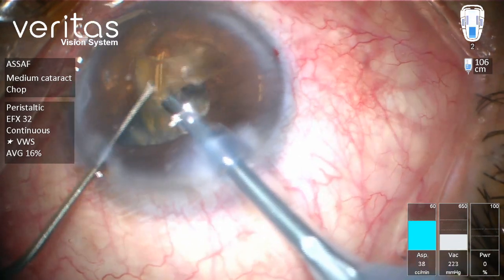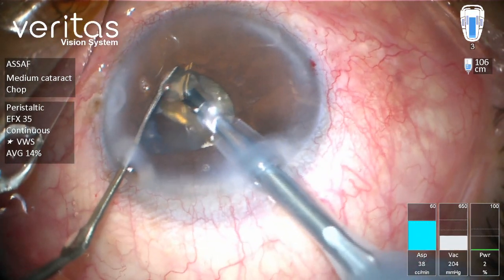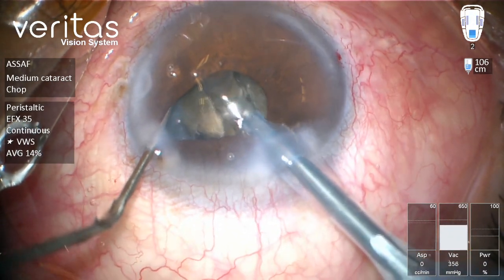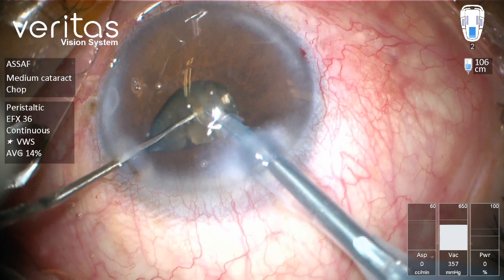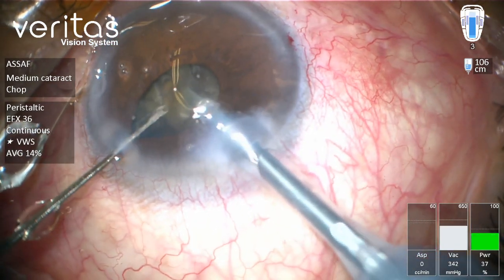As you can see, this is a pretty dense cataract and the pupil is getting smaller. I'll pass behind these quadrants — actually two quadrants together — trying to separate them. They are already separated now, so we can emulsify.